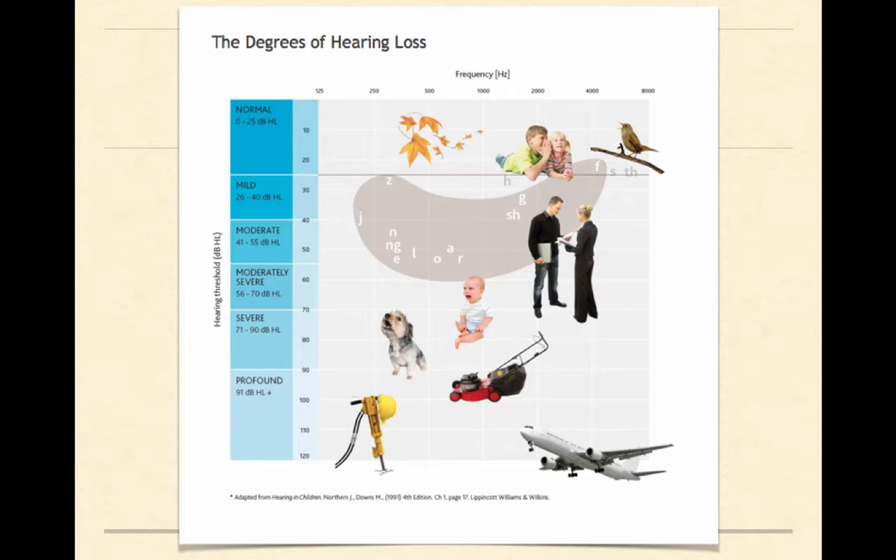This diagram shows the degrees of hearing loss. It also gives us a really good picture of what kinds of sounds you might hear with different degrees of hearing loss. So if you had normal hearing and all of your points fell within the normal range, then you would be able to hear leaves rustling, you would hear children whispering, you would hear birds chirping.